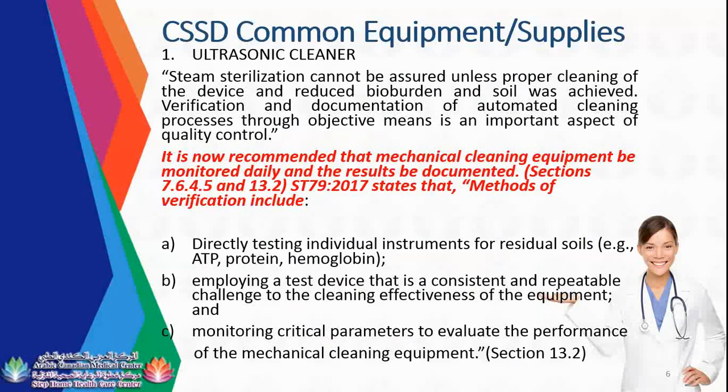Sterilization cannot be assured unless proper cleaning of the device and reduced bioburden and soil is achieved. Verification and documentation of the automated cleaning process through objective means is an important aspect of quality control.